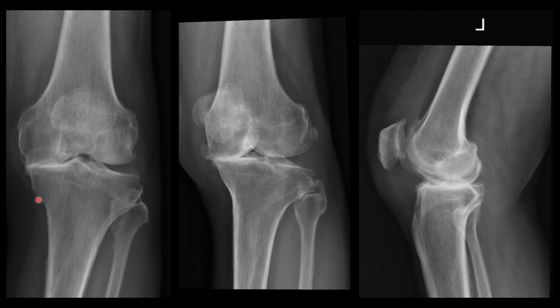So that's what we're assessing when we're looking at cartilage or joints, because we're expecting there to be menisci in there, we're expecting articular cartilage, and if the bone is on bone, then there probably isn't much left of that in there, so that's what we would be looking for and commenting on in the cartilage section.